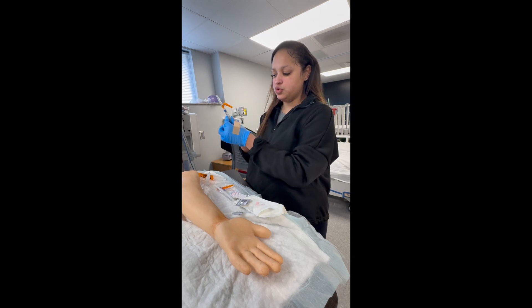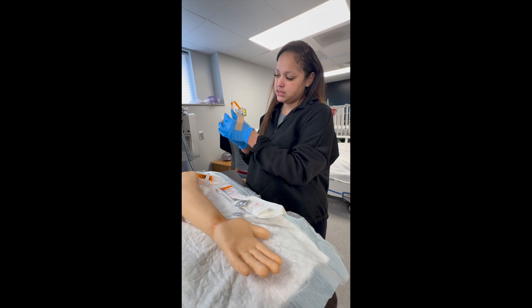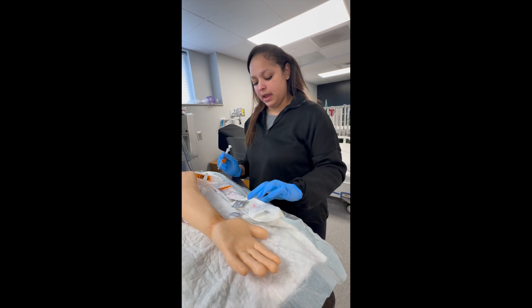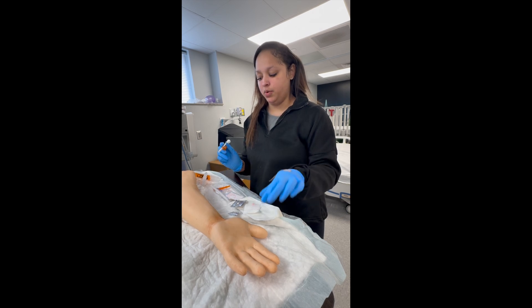I'll go ahead and draw back to one milliliter, which is adequate for a blood gas. I'll make sure my bevel is facing up so the syringe can feel how it should, and I'll make sure that I have a gauze on standby so I can compress the site when I remove the needle.